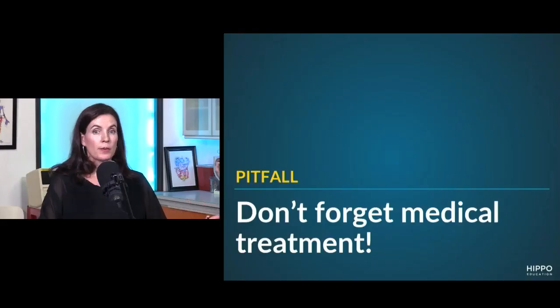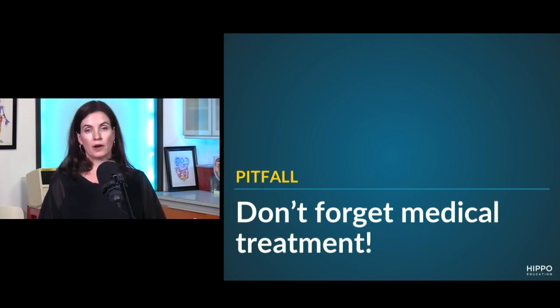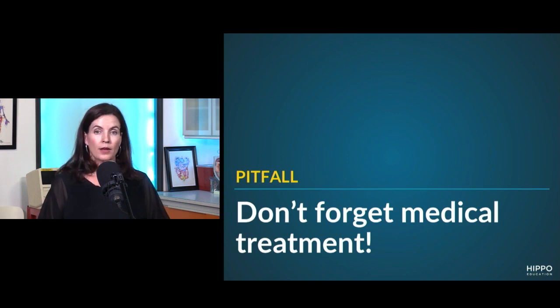The other thing to remember here is that you've got to treat their underlying disease, because the ventilator doesn't actually fix anybody's medical problem. It just buys you time and oxygenation while your other therapy kicks in. So if this is a pneumonia patient, don't walk away from this patient until you've given them appropriate resuscitation, antibiotics, the therapy they need. If this is CHF, same.